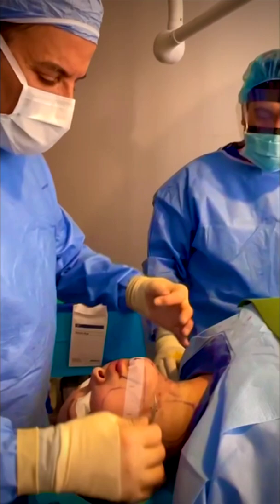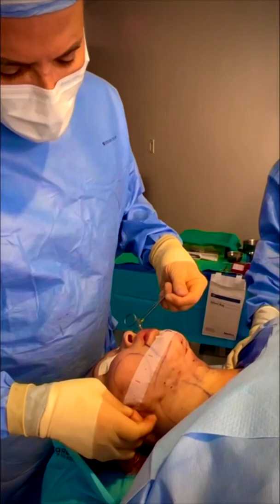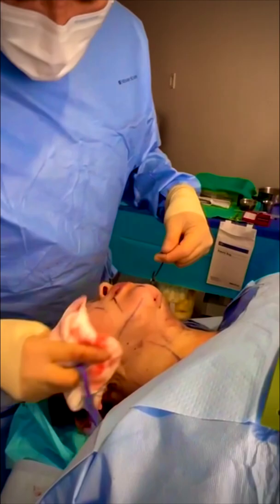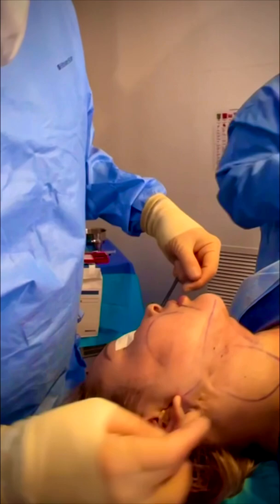We replace it, pivot it, put the light back on, and just come right out there. This is where we anchor — behind the ear. Everything here is very sterile, everything's been prepped. We always use the light because we want to make sure we know right where the tip is — we want to be right in the fatty layer, not too deep. These punctures will be open just a few days. We'll pull all this through, then pull it tight — and you can just see what MyElevate does, all the definition underneath there. We'll clean off some of the fluid and you can see she's got a beautiful snatched jawline. There's a little bit of dimpling back here, which we always expect, and that goes away in a few days.